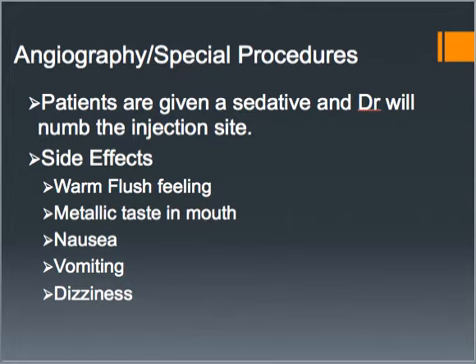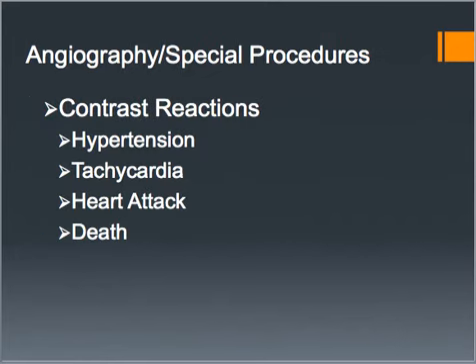Like I said, we use conscious sedation, but that patient is still aware at the time. So even though they might not remember it later, they know what's going on right then and there. So you need to communicate with them and talk to them. Other contrast reactions could be hypertension, tachycardia, heart attack, or possible death.